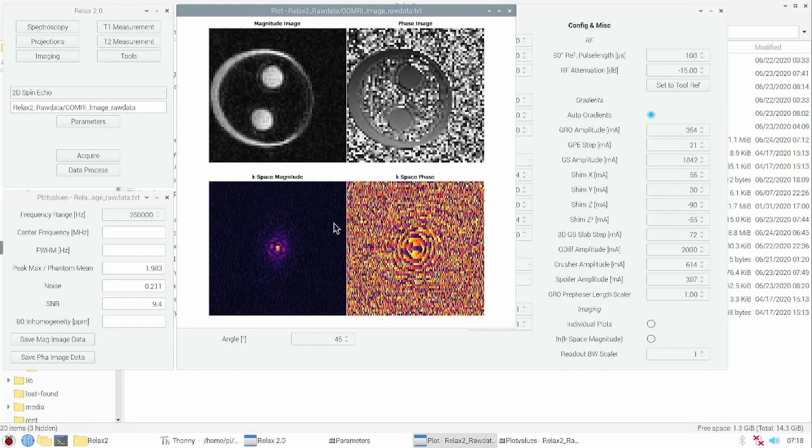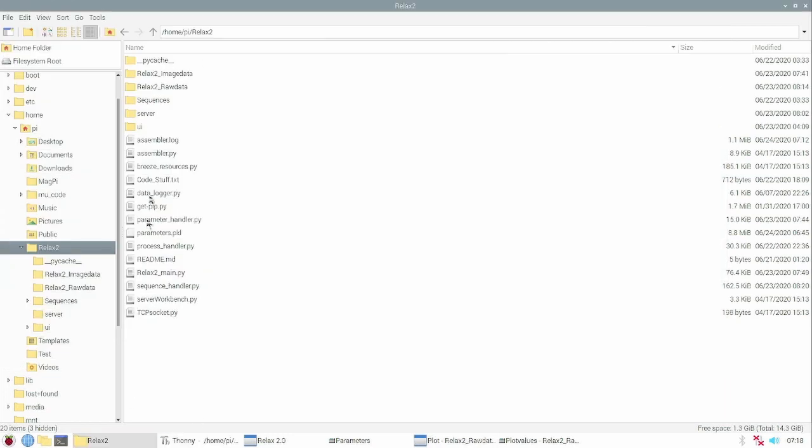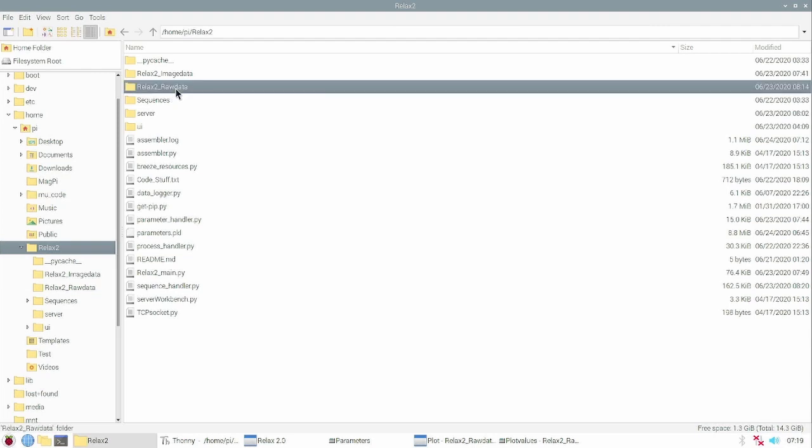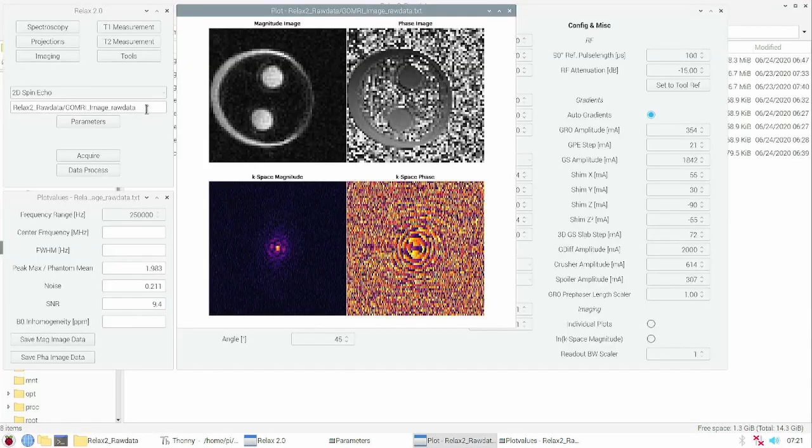The complex raw data gets stored every time you acquire, and by default the file gets overwritten every time. You can change the file name in the software or in the folder. You find the raw data in the relax2 raw data folder. This also enables the reconstruction of previous acquired data.